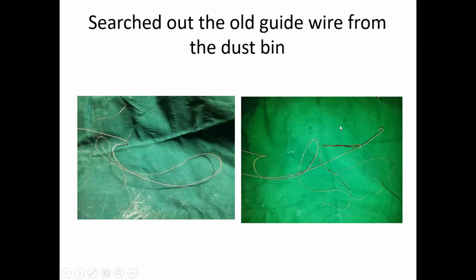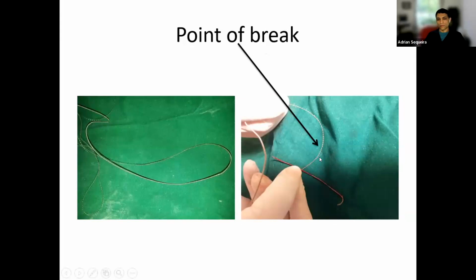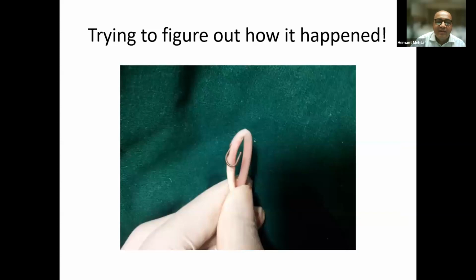I'll show you the broken tip. And you see, this was the tip where it broke. So now you appreciate what had happened exactly: the point of break, and the part of the wire got retained. So I was just trying to figure out how this could have happened.